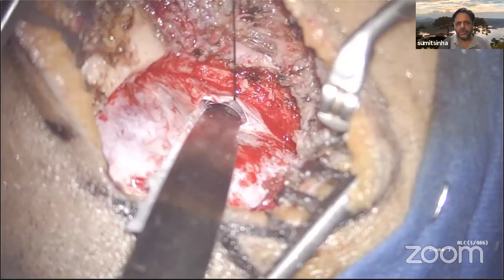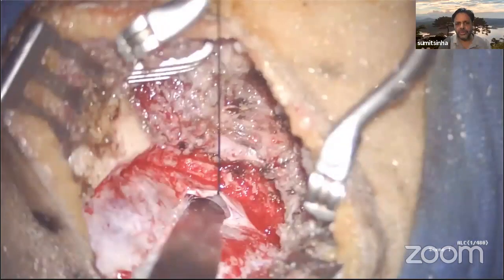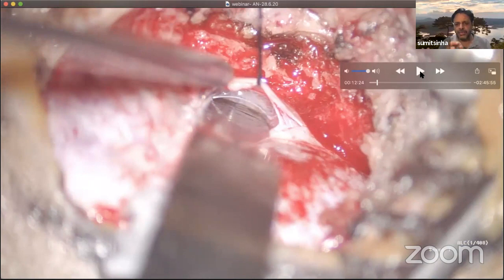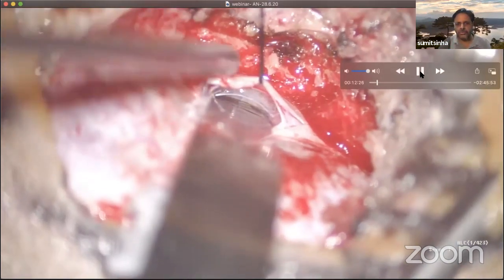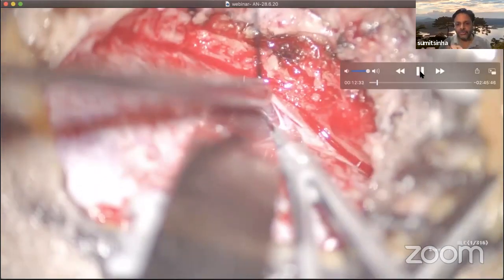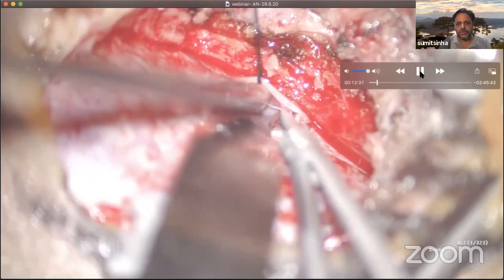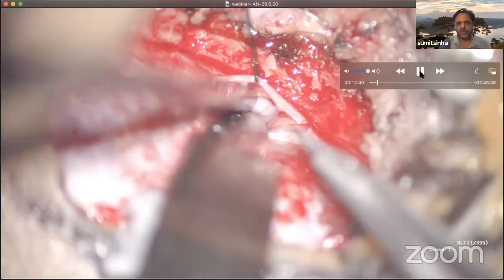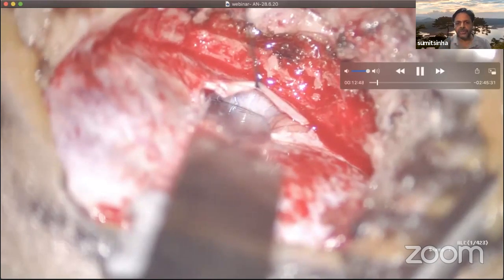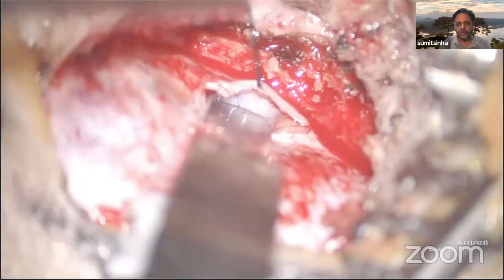In all the keyhole approaches, this is the most important step: the drainage of the CSF immediately after opening the dura. This is the fundamental law of keyhole craniotomy: open a very small dura, initially drain all the CSF, and as soon as the CSF drains, life becomes so simple. Initially it may be intimidating to some people that there is no space, but as soon as the CSF is drained, the brain goes down and there is ample space during the entire surgery. This is the most important key step in any keyhole surgery, and in this surgery in particular.